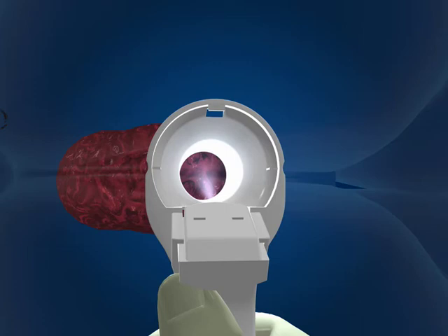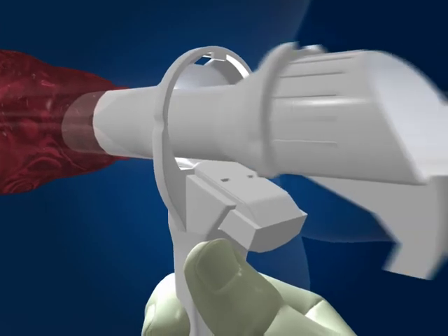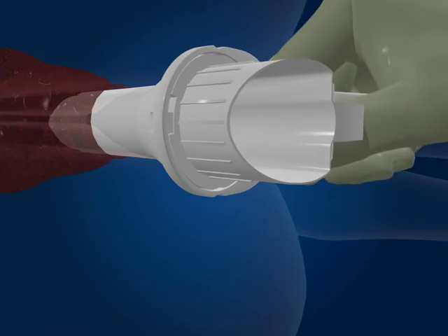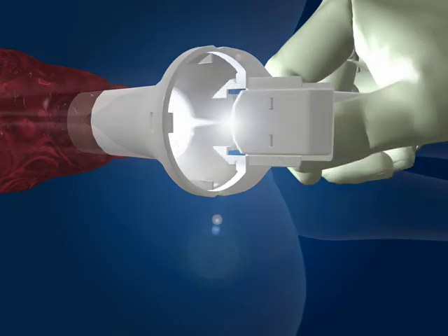If during the examination the Cyclopes needs to be rotated, smoothly replace the obturator, taking care not to trap any tissue, and rotate it clockwise until it locks. Once the obturator has locked into place, the Cyclopes can be rotated using the handle until it is in the desired position for use, and the obturator unlocked and removed as previously described.